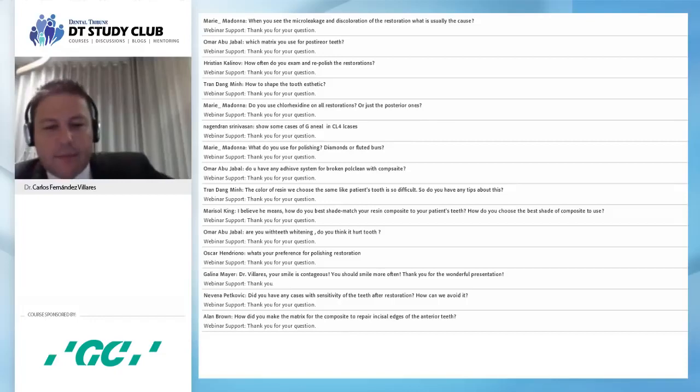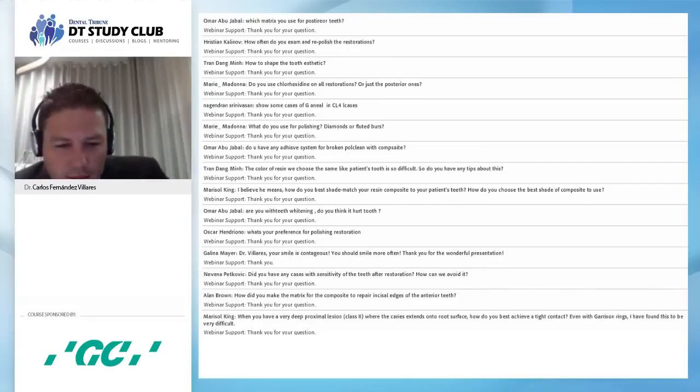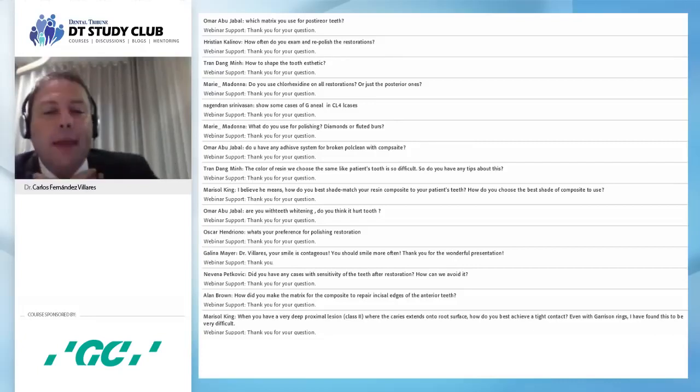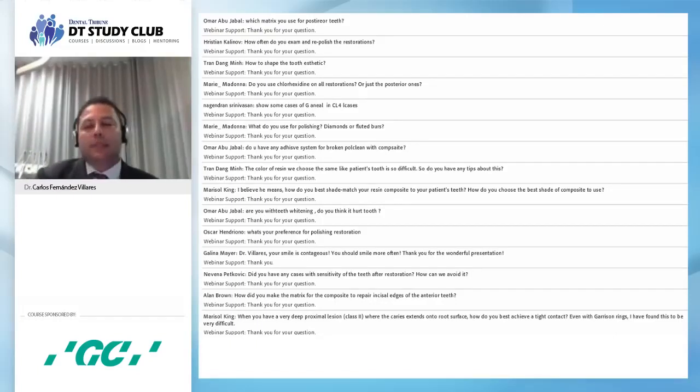Marisol, you asked me how I manage subgingival restorations. Normally, if it's very subgingival, I try to do it in two steps. First I make the deep margin elevation, which is the technique described by Pascal Magne and Roberto Spreafico in the article I mentioned during the lecture. And then I make an indirect restoration.